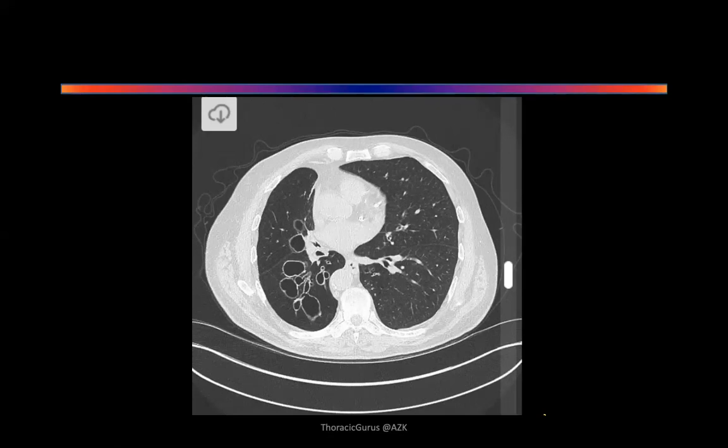Vikas. It's mediastinal shift, maybe. Yeah, there is mediastinal shift. And I think the vascularity of this particular lung is less on the periphery compared to the other side. Okay. Anything else? No, sir. That's it? Anything else on the other side?